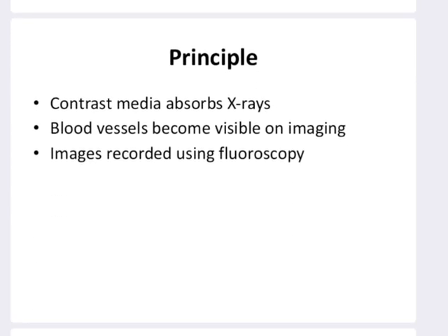Then next is about the principle. What is the principle of angiography? We use a contrast media that absorbs the X-rays, so that the blood vessels become visible while imaging, and these images are recorded by means of fluoroscopy. Fluoroscopy is a live imaging technique that was used in earlier times.